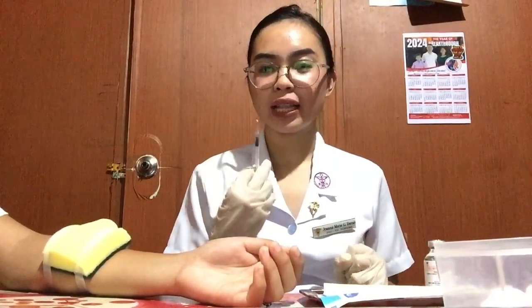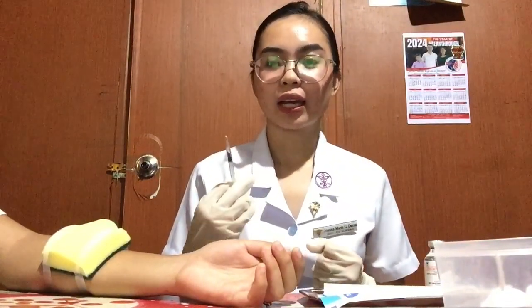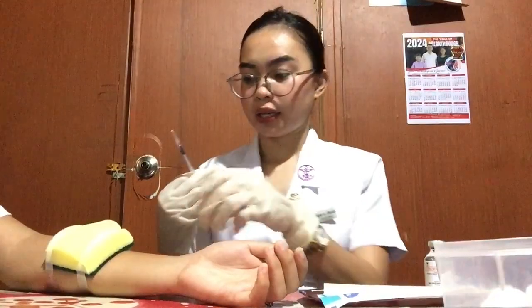Since I'm done putting the syringe into the vial, now I'm going to hold the vial upside down, for example with the base lower than the top, and move the needle tip so that it is below the fluid level, and withdraw the medication. Ensure that the needle tip is below the fluid, and gradually withdraw the medication.